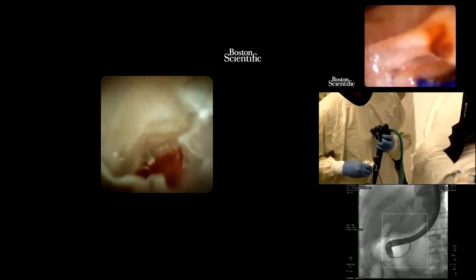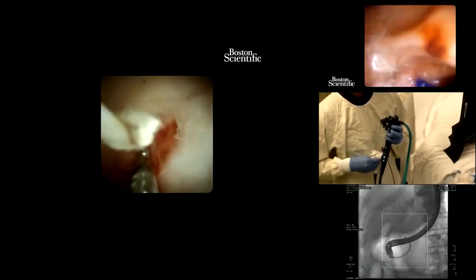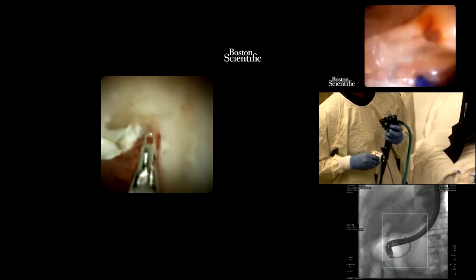So all that I'm going to do now is to perform my last pass, if required, and then we are going to go and deploy a stent. I'm going to drive myself because we are right in the tumor mass. So our algorithm in clinical practice is that everybody will get an EUS before, and then we proceed to SpyGlass only if you don't have a diagnosis. And that was the case in this particular patient.